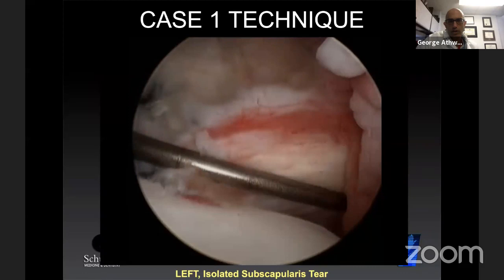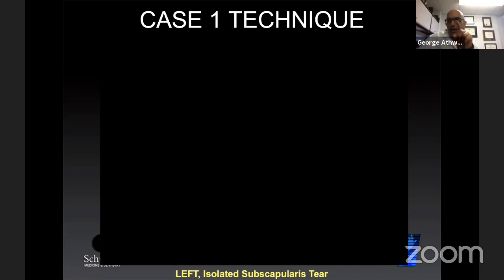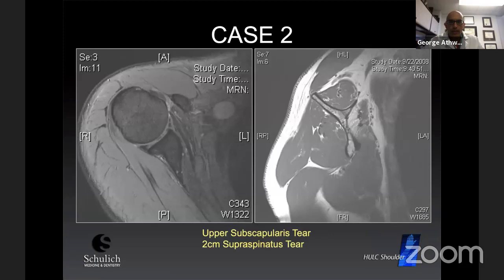And I'll try to push on this, and you can see that the humeral head translates anteriorly as I pull on that subscap. So that's a single row technique. And as I mentioned, now I'll tend to stagger those anchors to get more coverage across the footprint. This is another case here.